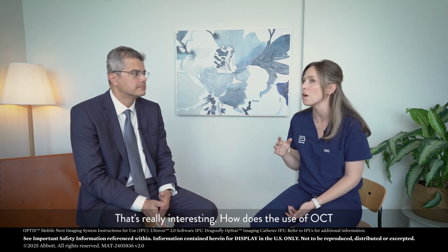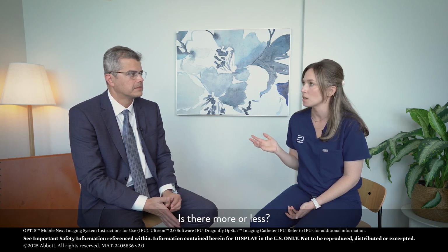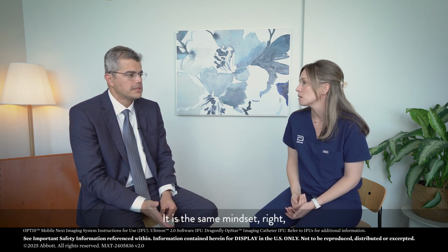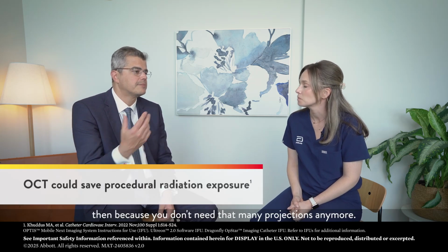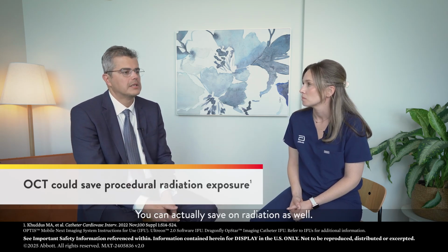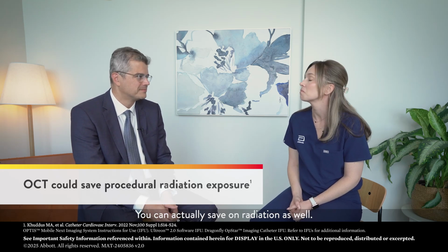That's really interesting. How does the use of OCT impact X-ray exposure to the physician? Is there more or less? It's the same mindset, right? Because you don't need that many projections anymore, you can actually save on radiation as well.